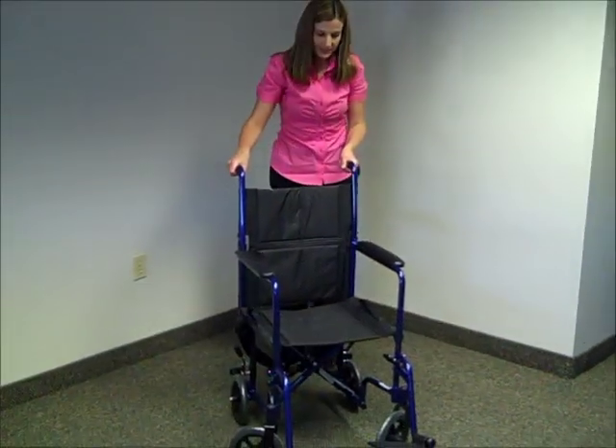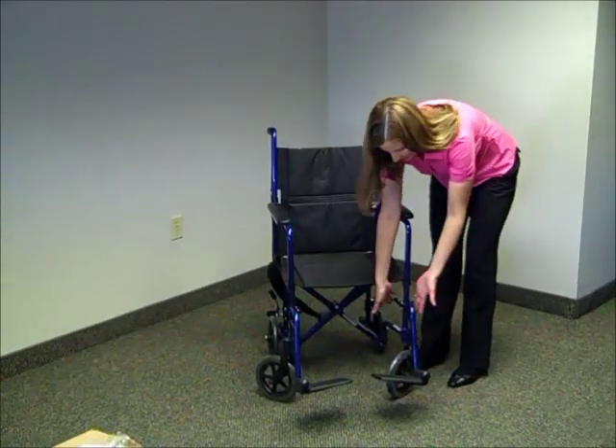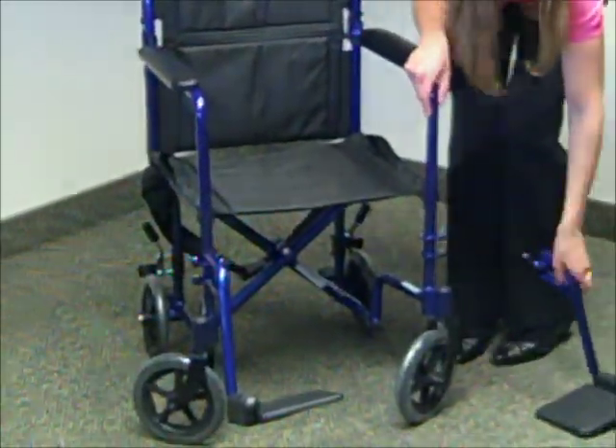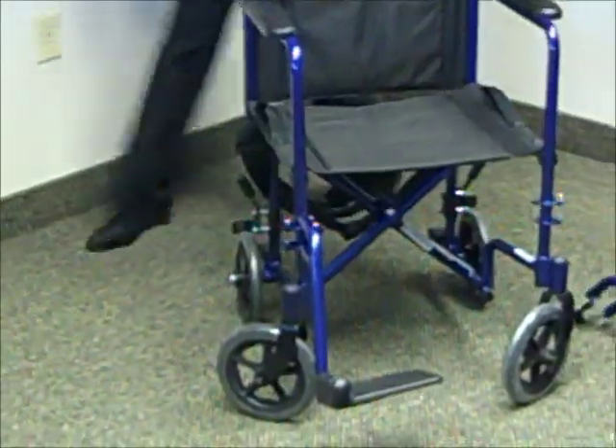To get it ready again to transport, first you want to remove the footrest. Notice there's a black lever — just go ahead and pull that. Remove the footrest and do the same to the other side.